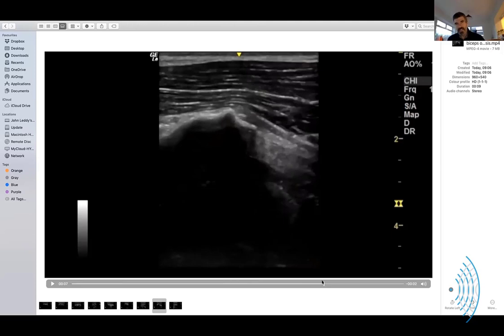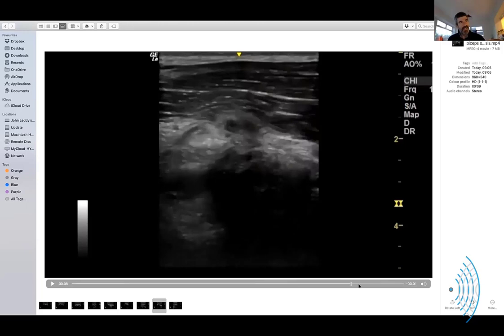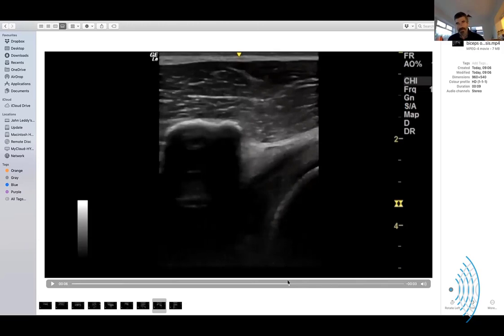Yep. You know, I'm not suggesting that this is something that anyone should take any notice of. I'm just saying there's a little bit of calcium in there. But in the greater scheme of things, that's not his problem. Metabolically, that is just evidence that he has lived an active life, or metabolically, that's just what it is. It's just what it is. We all get bits, you know, if you scan long enough, you see it everywhere. And particularly in people like this gentleman who had used his body well.